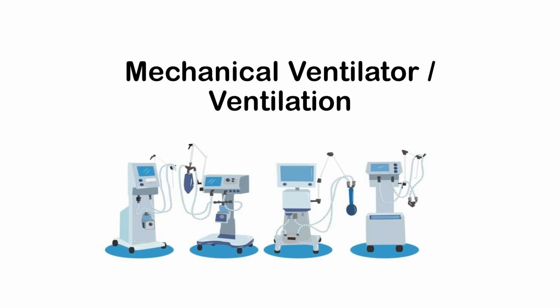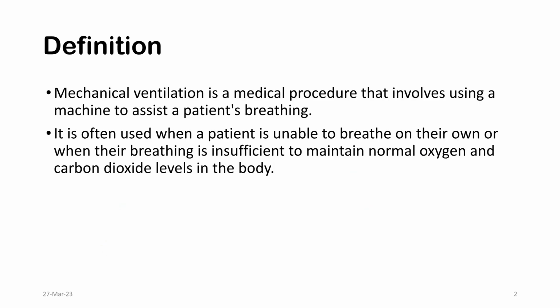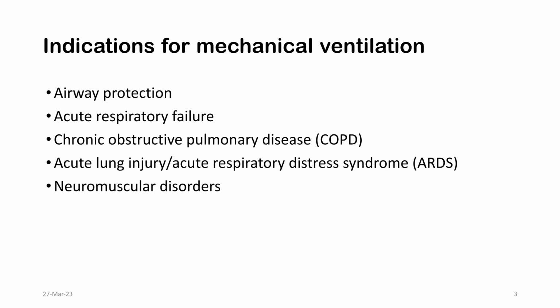This video will cover mechanical ventilators and the medical procedure of mechanical ventilation. Mechanical ventilation assists a patient's breathing using a machine. It is used when a patient cannot breathe on their own or when breathing is insufficient to maintain normal oxygen and carbon dioxide levels.